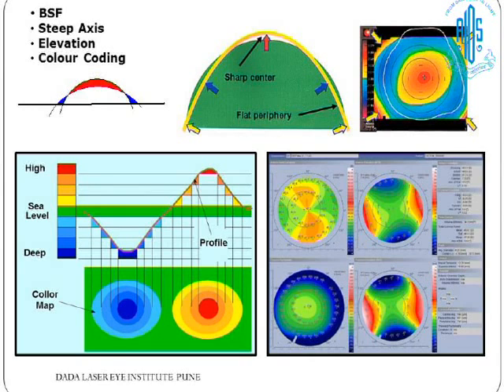Now, if you see the curvature maps and elevation maps, the color coding is exactly opposite. And this is very important to understand. Why is that? Because it is basically comparing it to the sea level. So you'll always see that the colors are getting exchanged in the elevation map and the curvature map. And once you understand this slide, then everything becomes very easy.